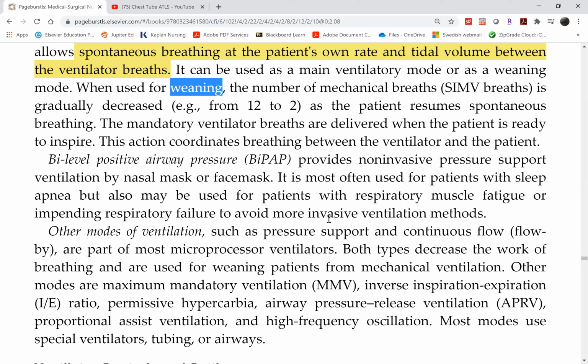We already did the settings, so when caring for a patient on a ventilator, as stated here, regardless of the alarm that goes off, when you enter the room, check your patient first, and if the patient checks out fine, go to check the vent.